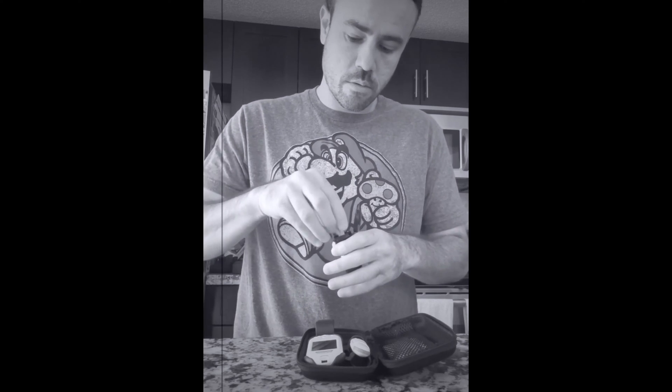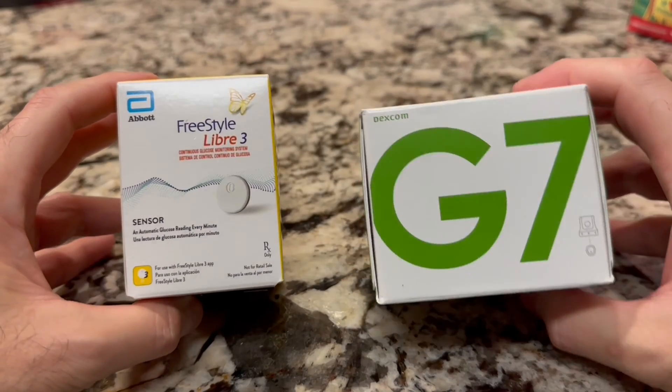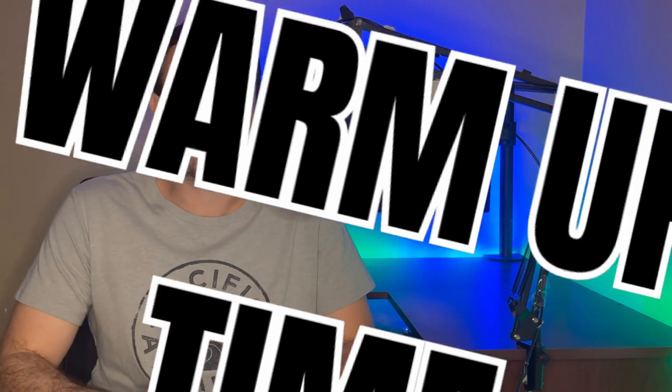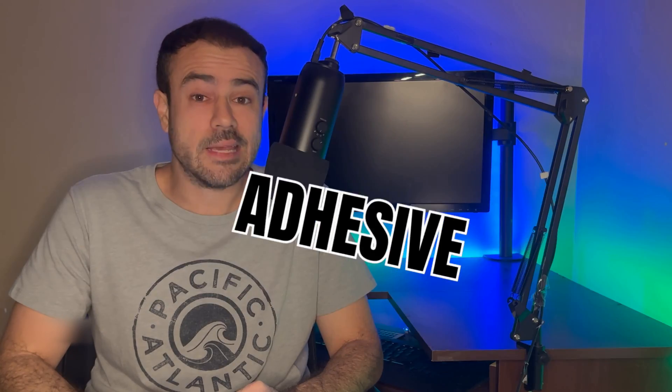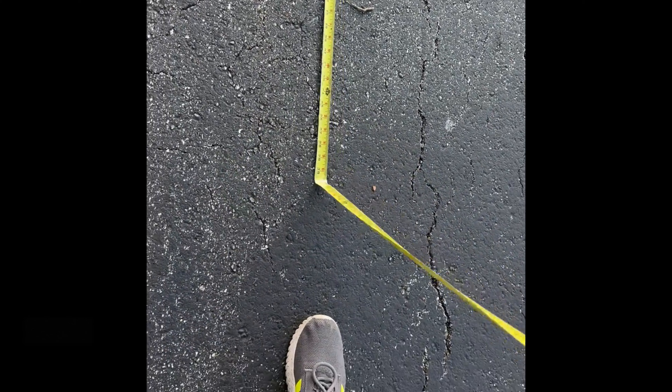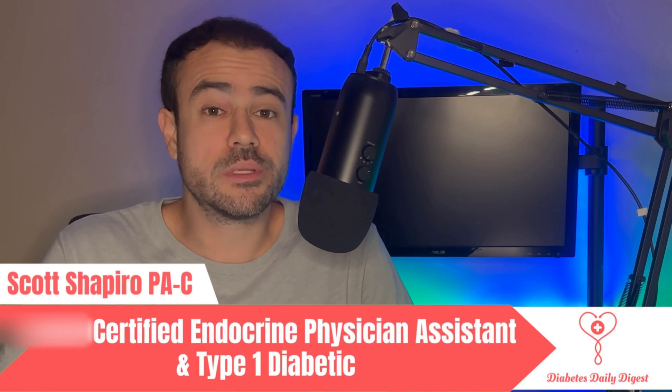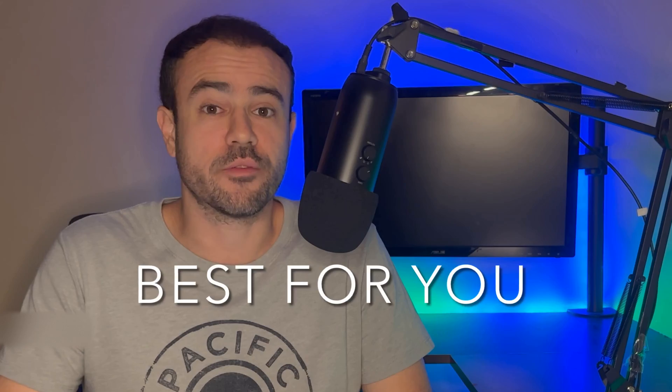Ten years ago I got my first CGM. It was big and clunky, it required multiple calibrations a day, but it paved the way to the amazing technology I'm going to go over today. I got my hands on a Dexcom G7 and a Freestyle Libre 3. In this video I'm going to go over every detail you need to know — accuracy, size, software, warm-up time, sensor expiration, adhesive. I even measured the Bluetooth range of each CGM with a tape measure. Stay tuned to get all the info you need to help you decide which CGM is best for you.